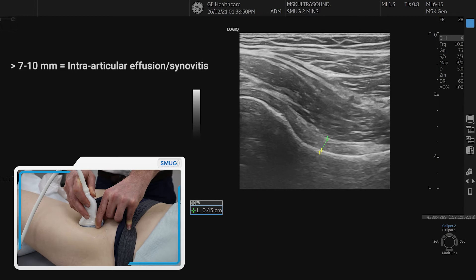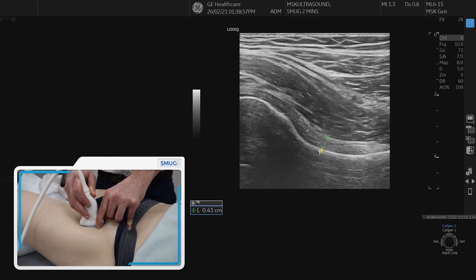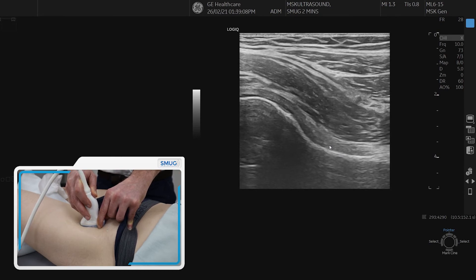Some of the studies show that more than seven millimeters, some talk about more than 10 millimeters, may indicate some thickening and synovitis. And if there is an intraarticular effusion, then it generally accumulates down the neck, just underneath the anterior aspect of the capsule, where the arrow is pointing to now.